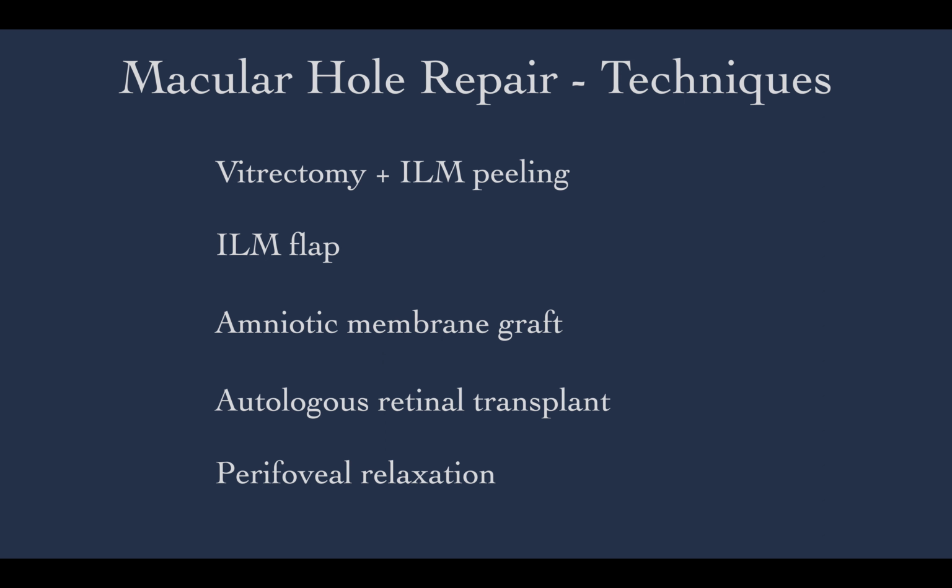Several mechanisms have been proposed to explain the tissue repair that occurs following the use of ILM flap technique. ILM may possess Müller cell fragments, which may cause glial cell proliferation, allowing macular hole closure. ILM may also play a role as scaffold for tissue proliferation, creating a microenvironment that encourages correct photoreceptor location and improvement of the surgical outcomes.